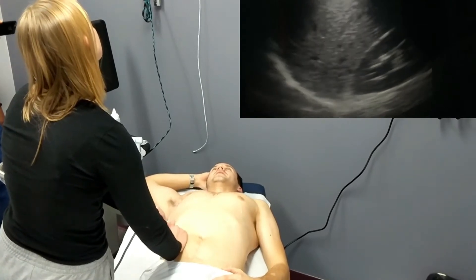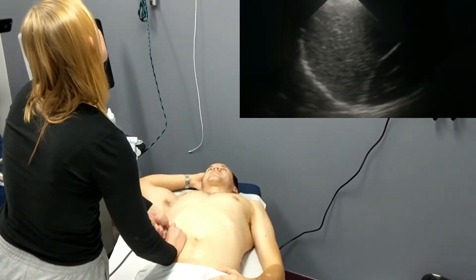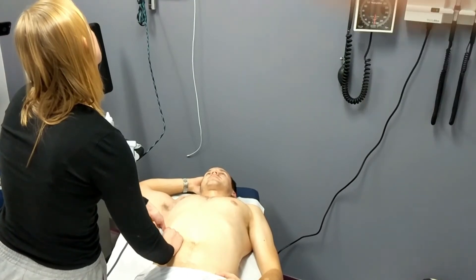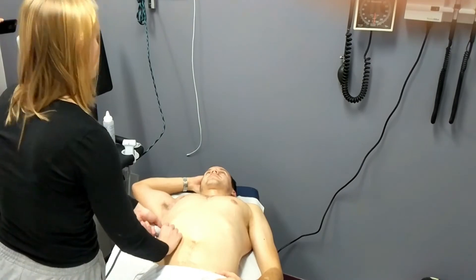She's now moving on to the FAST exam, examining Morrison's pouch — the area between the liver and the kidney. We can see here that there's a nice mirror imaging showing us that the lung on that side doesn't have extra fluid at its base.